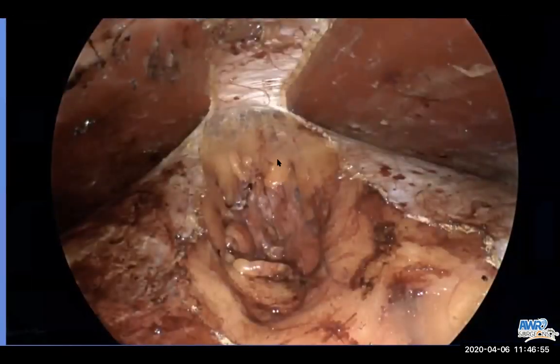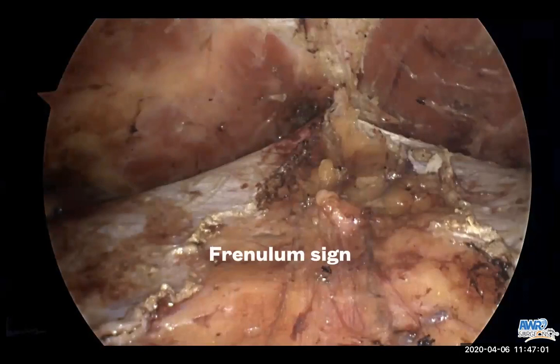This is the same volcano sign shown even more elaborately. At the xiphoid, there is subxiphoid fat, and the divided edge of the PRS on either side leads to the appearance of the frenulum of the prepuce. So this is called the frenulum sign.